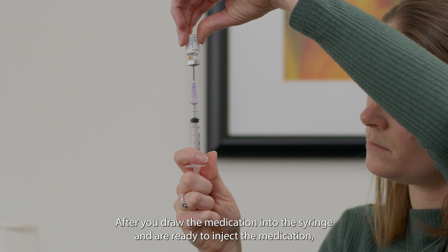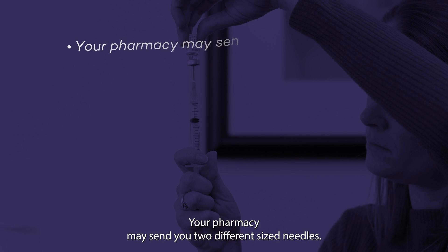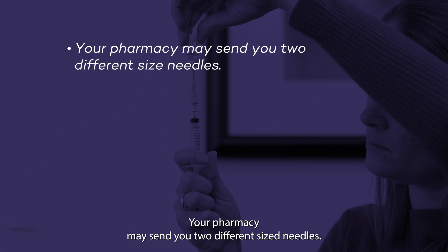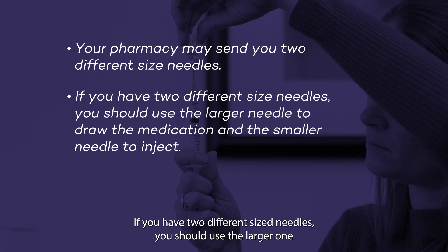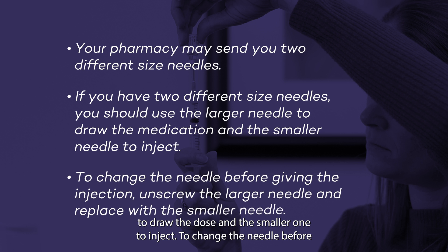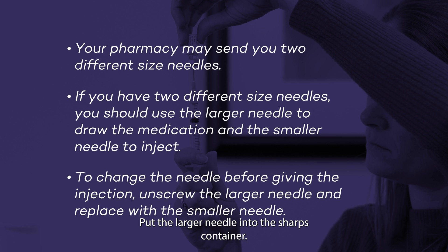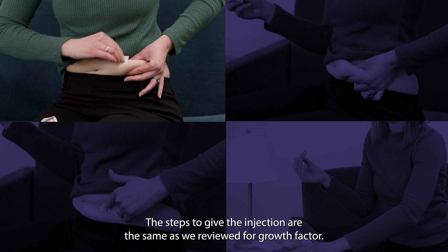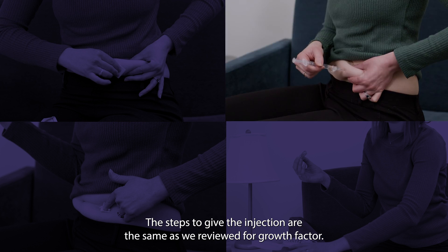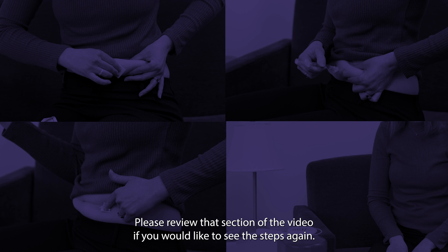After you draw the medication into the syringe, make sure you have the right size needle. If you have two different size needles, use the larger one to draw the dose and the smaller one to inject. To change the needle before giving the injection, unscrew the large needle and replace it with the smaller needle, then put the larger needle into the sharps container. The steps to give the injection are the same as reviewed for Growth Factor — please review that section of the video if you would like to see the steps again.